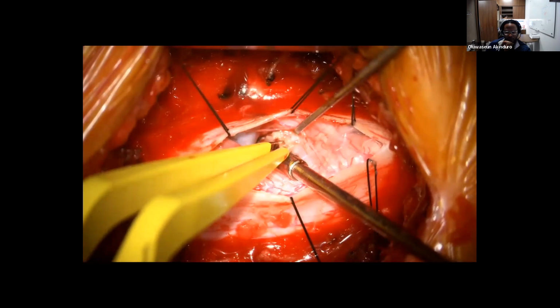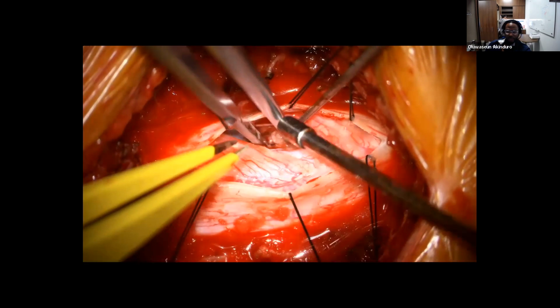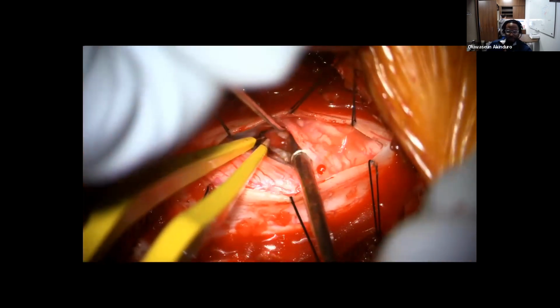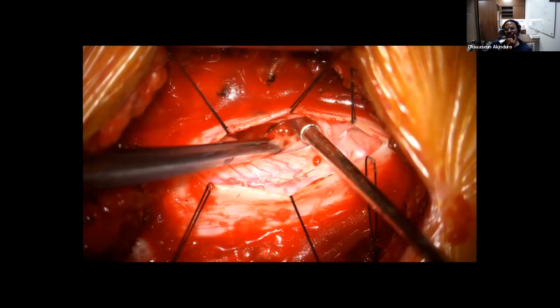So we identified it laterally, and then we cauterized the capsule of it. We weren't planning to even consider trying to just remove it en bloc, just because of the size of it and how close it was and how compressive it was on the spinal cord.